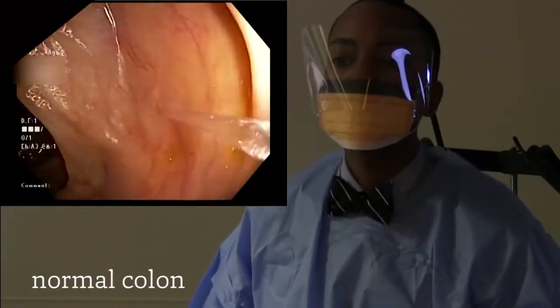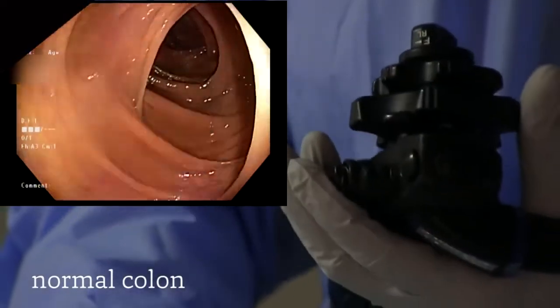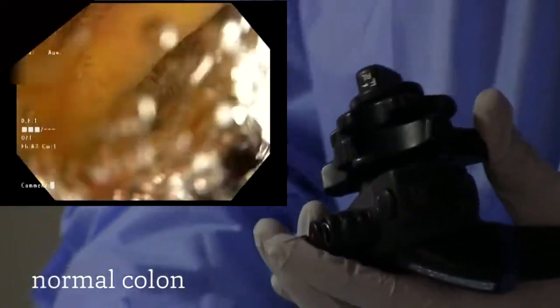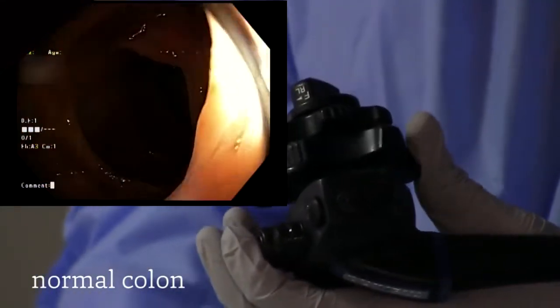We inspect carefully to look for polyps. Polyps are growths of tissue that can occur within the colon, and they can also be precancerous. If found, they would be removed at the time of the colonoscopy.